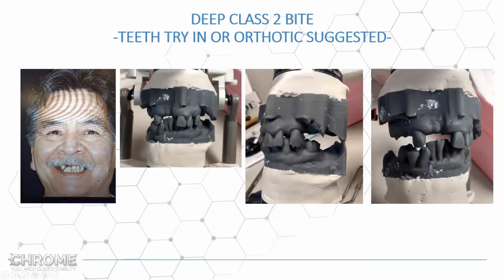Sometimes when we make these Shimbashi measurements, this might be 16 or 15, but when I open this on the articulator, I try to keep the canines in a position where they could have canine guidance, shallow canine guidance. And I watch the plane of occlusion of the opposing arch too, to see if we can get the guidance we need plus a decent plane of occlusion, and not resort to huge bite opening. So that's something that has to be used with discretion, but that's part of the analysis of these kinds of cases.